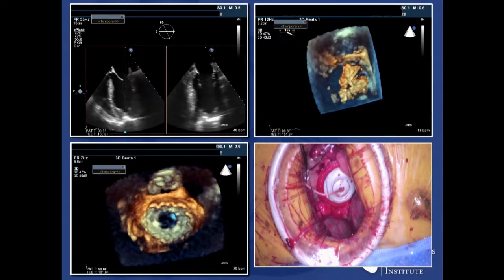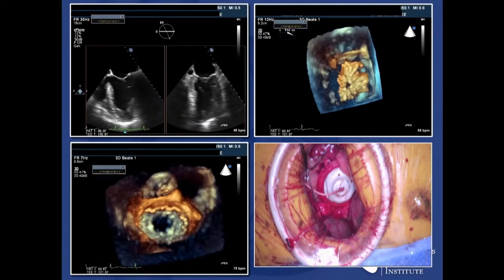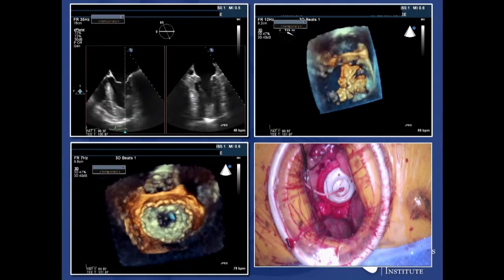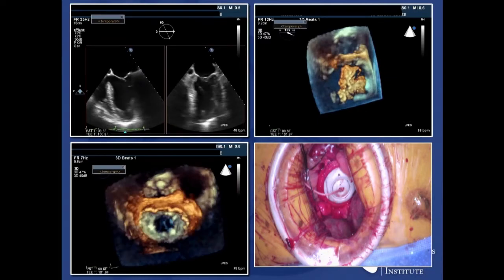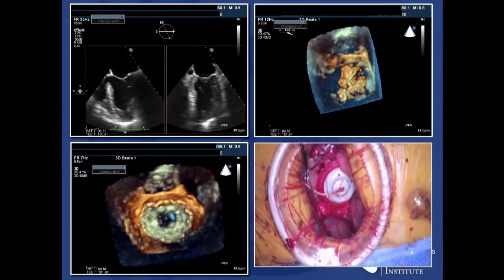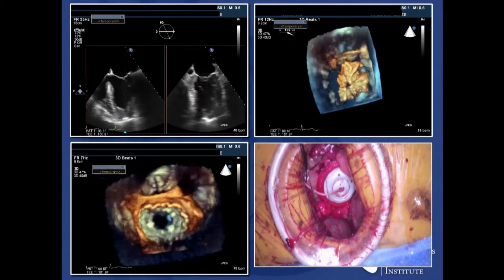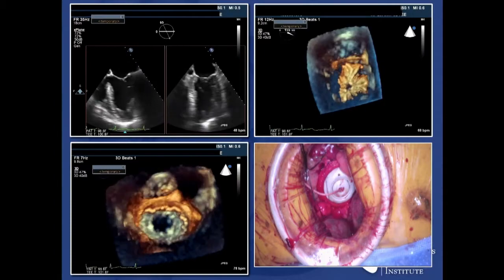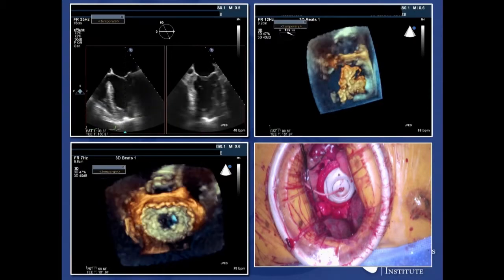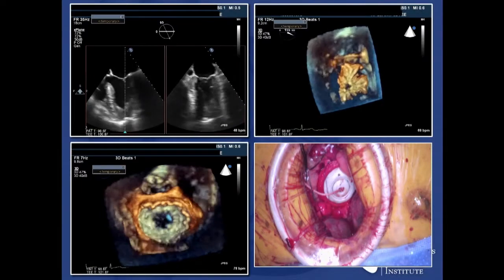Here's how it's done. In the top left-hand side, you can see a nice X-plane view with TEE imaging showing the mitral valve. It's very important when doing these to get a really nice long-axis view of the LV because you want to see where the apex is and have a lot of confidence in the apical puncture. That's unlike your TA-TAVR — you have to change your mindset when you're doing TA-TMVR, because your apical puncture commits you to the valve orientation. It's very difficult to orient your valve any other way once you've chosen your apical spot, unlike aortic valve replacement in which the valve will just self-center. The mitral valve is much less forgiving.